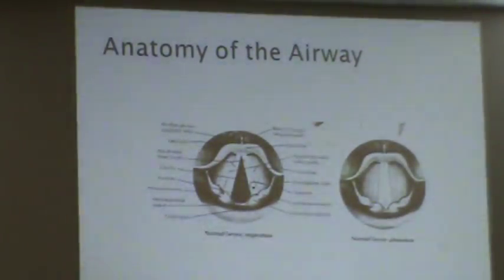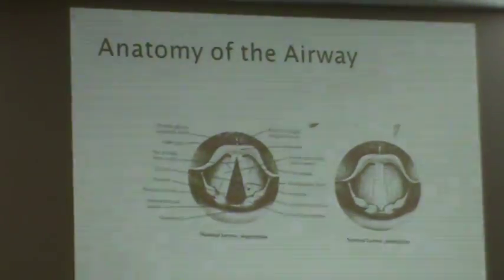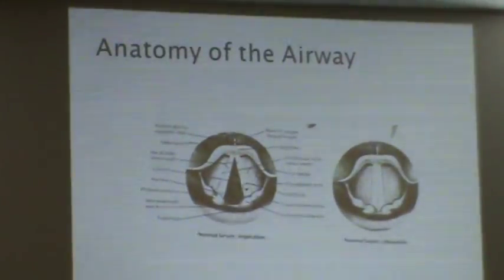And if you know the anatomy and the structures of what you're supposed to see, then that'll aid you when you don't have a clear view or if there's some distorted anatomy. So sometimes if there's some severe distortion of anatomy, you may just want to trace down on the structures that you can identify and know and follow those into where you think the vocal cord should be, and sometimes that will save you.